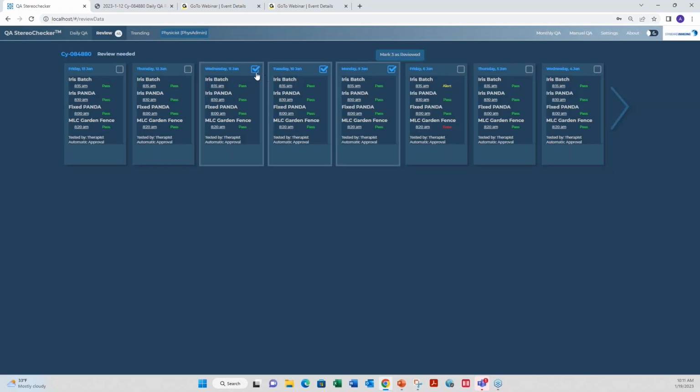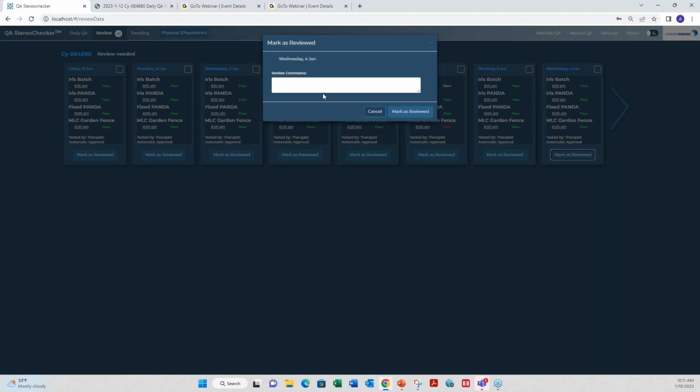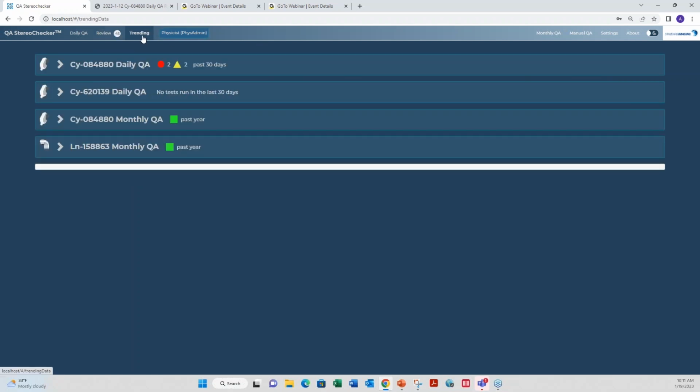Or you can choose to simply mark a single day as reviewed if you're somebody who's checking these on a daily basis, right? And again, the opportunity there to make a comment. Just going to leave them all there for demo purposes. And of course, if you had something like alerts or errors here, you would want to take a look at your trending. What is that telling us?